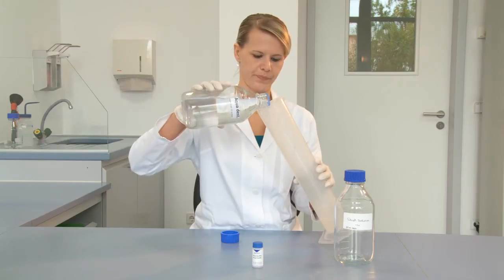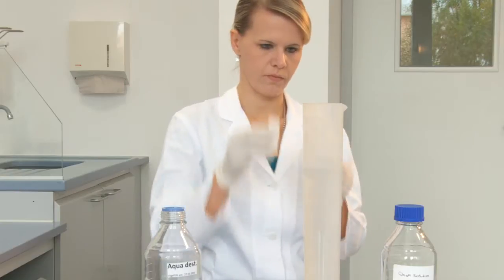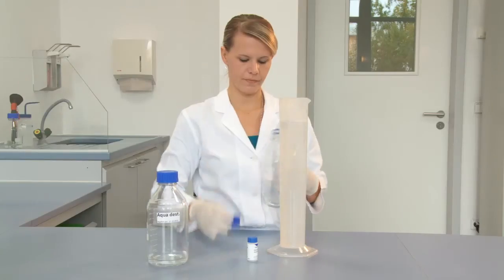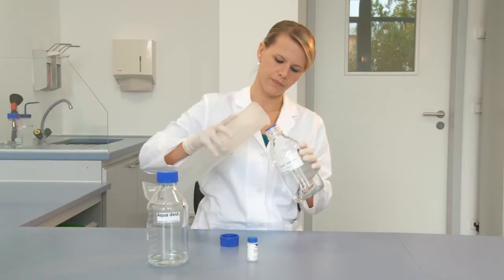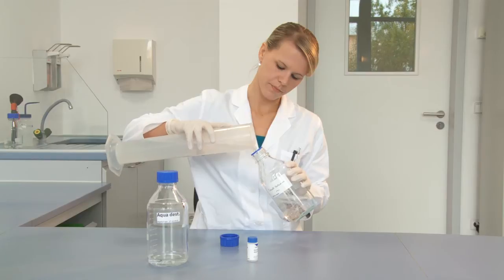The contents of each bottle of the wash buffer concentrate must be diluted to a final volume of 1 litre by the addition of distilled water. Once prepared, this ready-to-use wash solution can be stored for at least 30 days at 2 to 8 degrees Celsius.